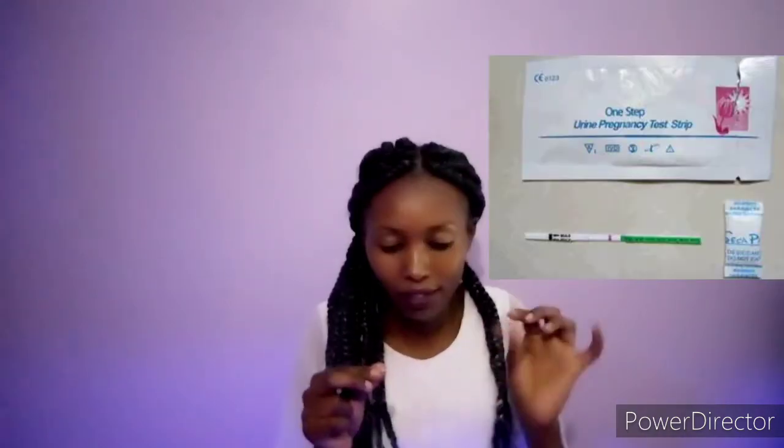It's not as big as you think, it's just a small capping. Look at it. There's a limit where you're supposed to put your urine. While you're using this type of pregnancy test, what you're using is your urine.